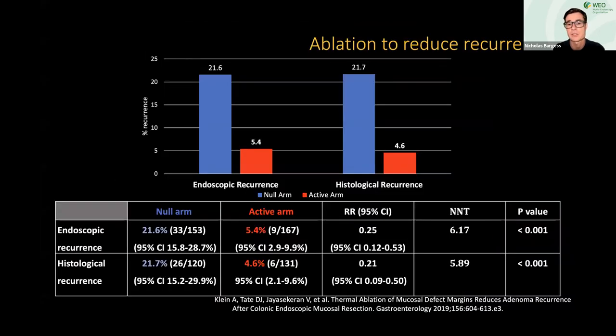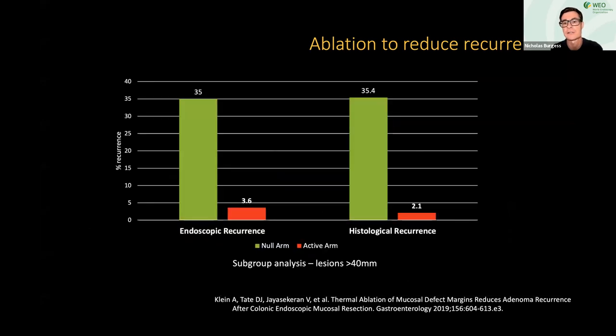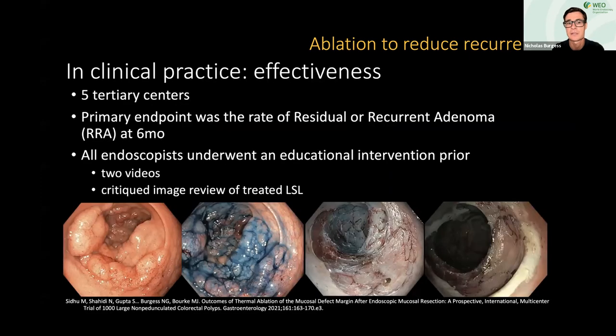And then we've done a randomized trial that shows that this really does significantly reduce recurrence rates, particularly in larger lesions. So this is over 40 millimeters in size. Recurrence rates are significantly reduced.